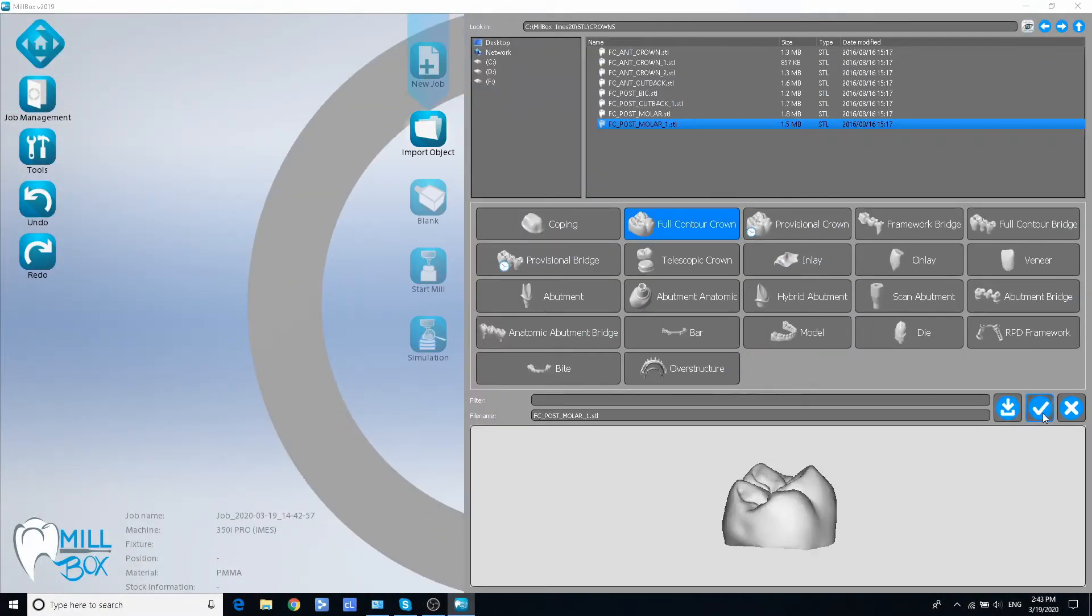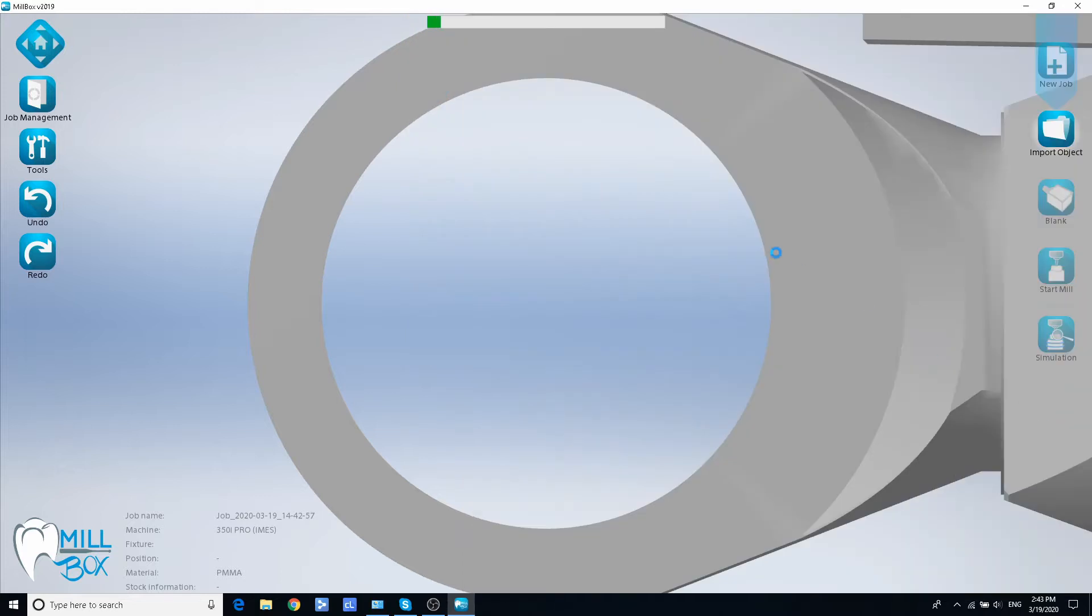Hello everyone! In this video we are going to show you how to add a new blank size in Millbox.